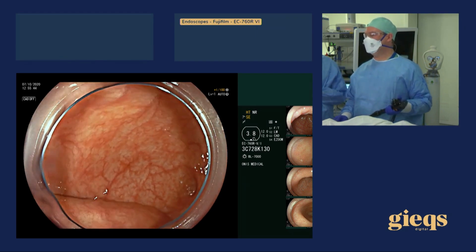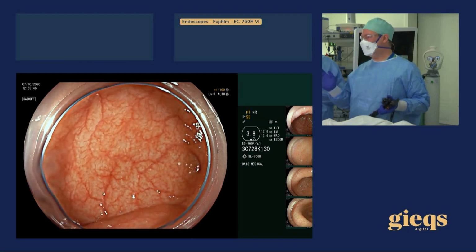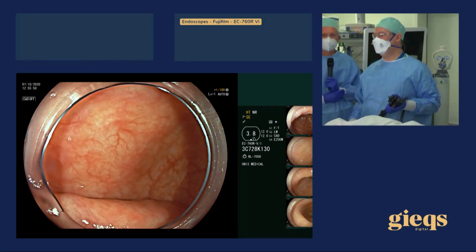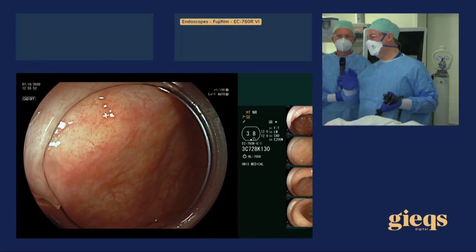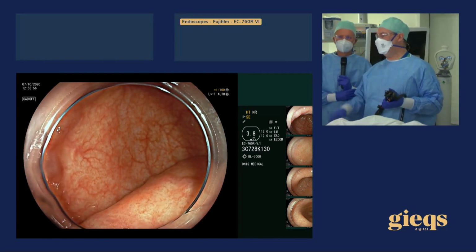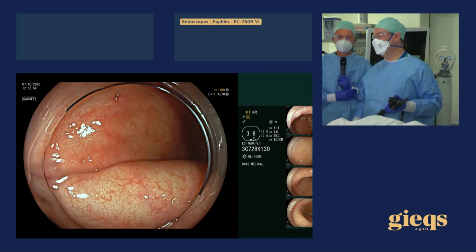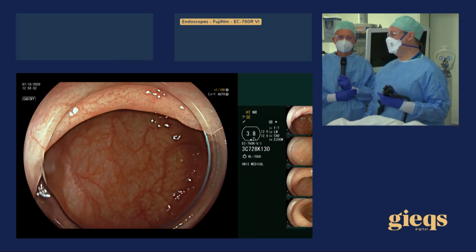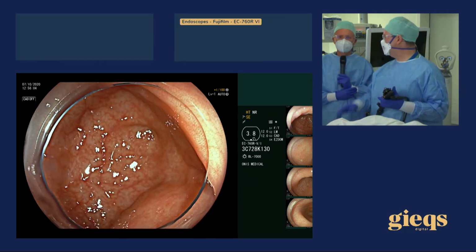And then no residual inflammation. Here we can accept small erythema, that is okay. A little bit of edema, that's okay. So it should not be Mayo 0, 0, 0 all over the place. But if you have a lot of ulcerations and it's full of erosions, then it becomes very difficult to distinguish inflammation from neoplasia. So this is the ideal setting.